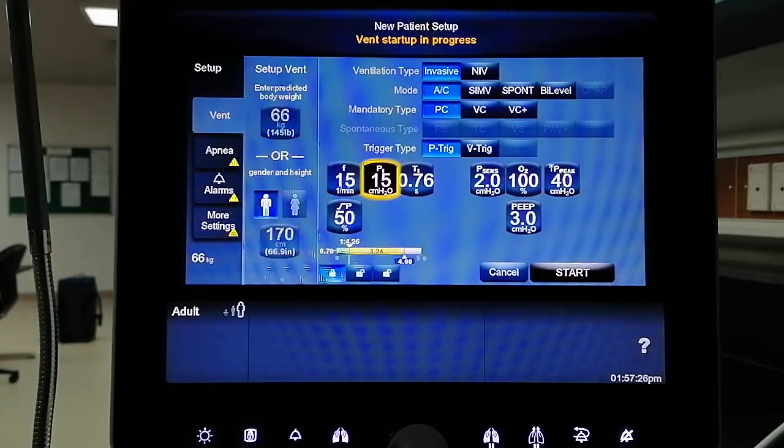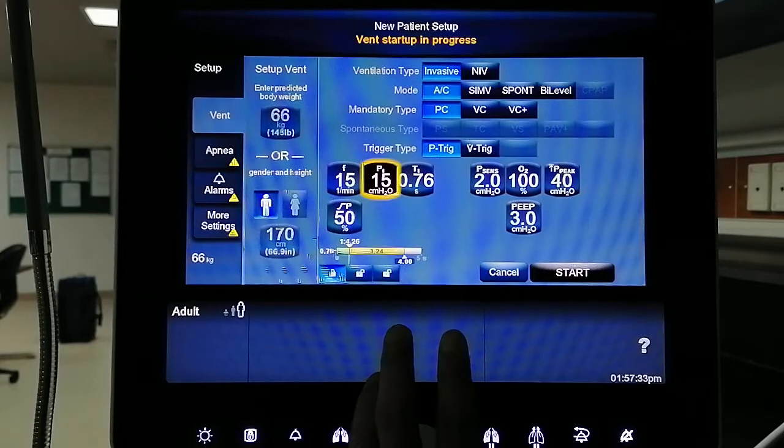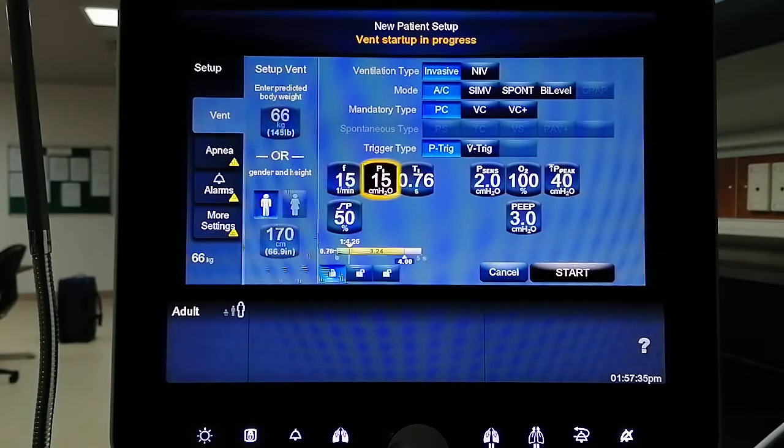Or later, when the ventilator operates, we will see whether the total pressure will be PI plus the PEEP level. The PI does not affect any time elements. So let's say we need 18.